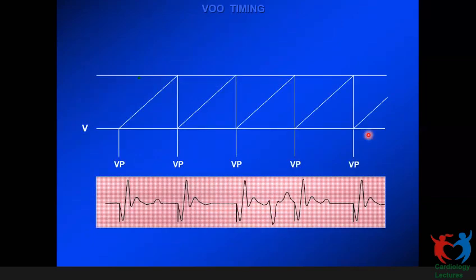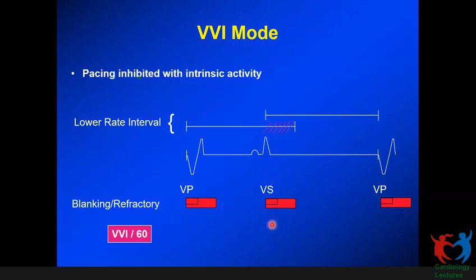And the timing cycle might look like this. Although the pacemaker will be sensing the electrogram, here, in order to explain in relation to the ECG, we have sketched the actual ECG itself, but keep in mind that the pacemaker senses the tip to ring intracardiac electrogram. So V-pace starts a low rate timer, and at the end of it delivers V-pace. Disregarding an intrinsic activation that might happen, there is no V-sense happening. So that's VOO.